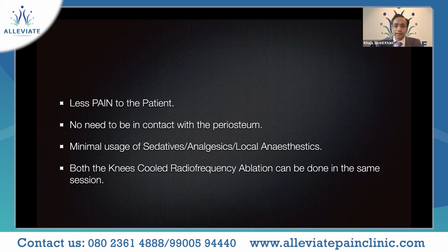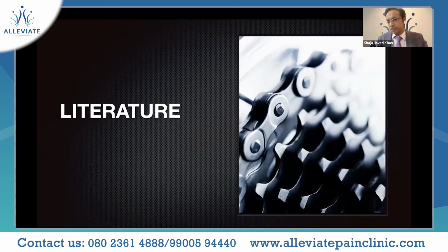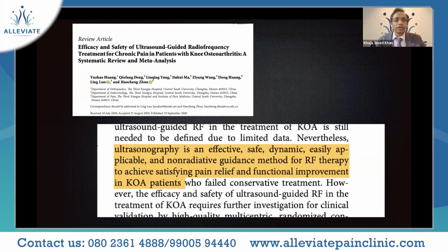Right. So let's have a look at the literature, because whatever discussions we do, the very important thing is to have corroborative evidence as well. This is a study on the efficacy and safety of ultrasound guided intervention for the treatment of chronic pain in patients with knee osteoarthritis. This is a systematic review and meta-analysis, and they concluded that ultrasound is an effective, safe, dynamic, easily applicable, and non-radiative guidance method for radiofrequency therapy to achieve satisfying pain relief and functional improvement in knee osteoarthritis patients.